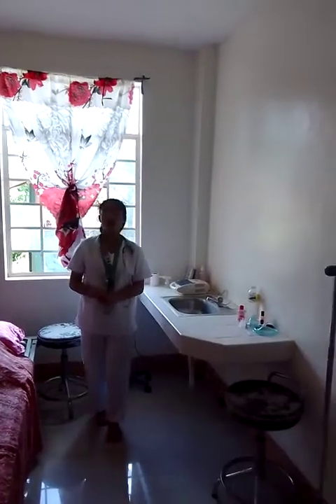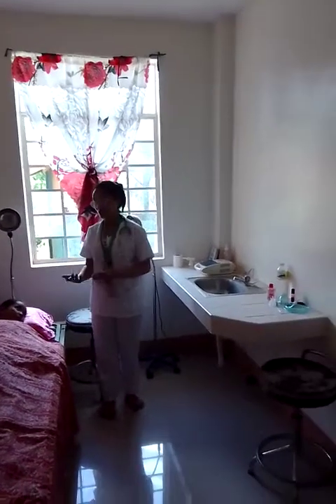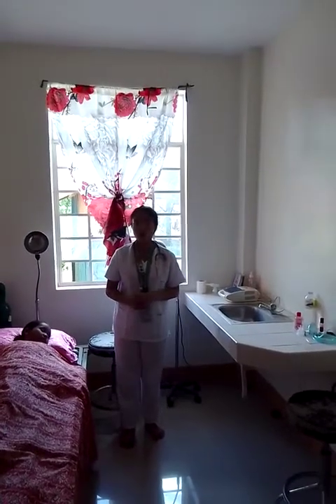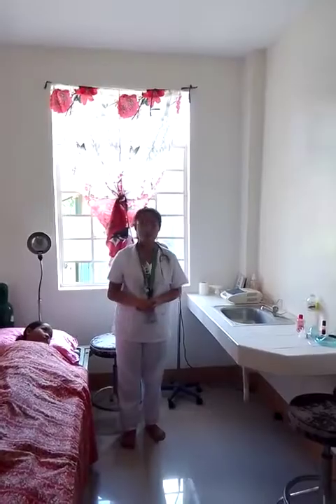Okay. The next thing that we need to do is explain the procedure to the patient. We explain to the patient what we are going to do today, and the most important thing is we need to verify our patient or identify them.